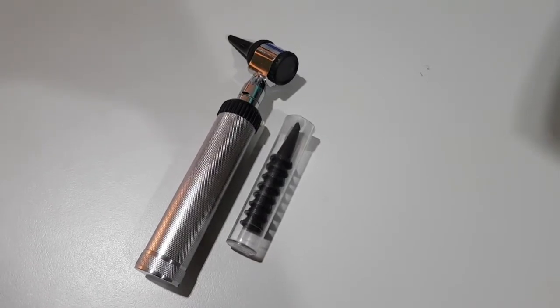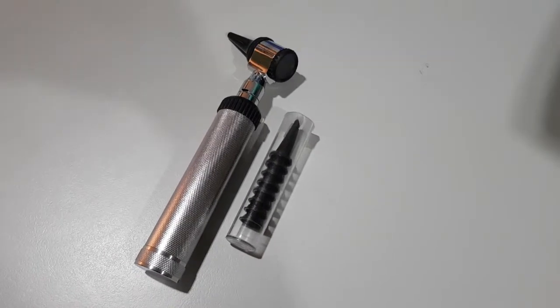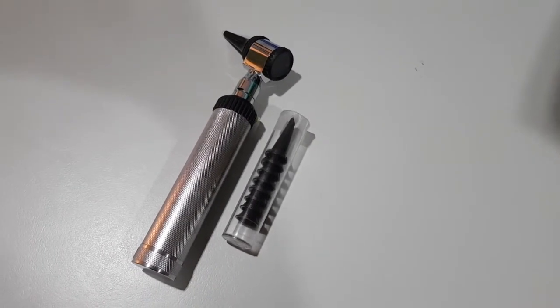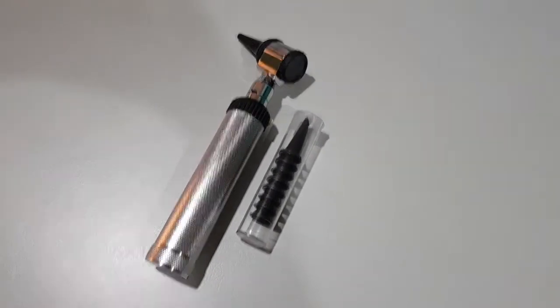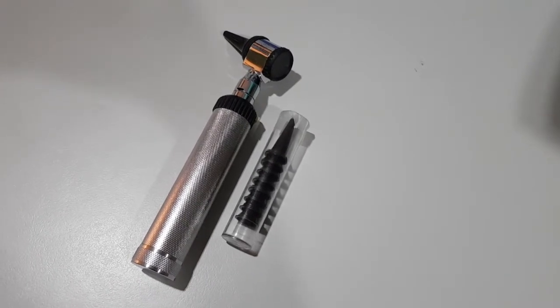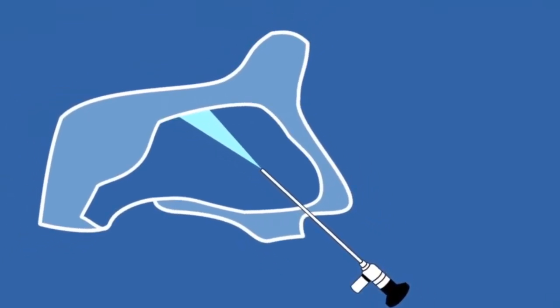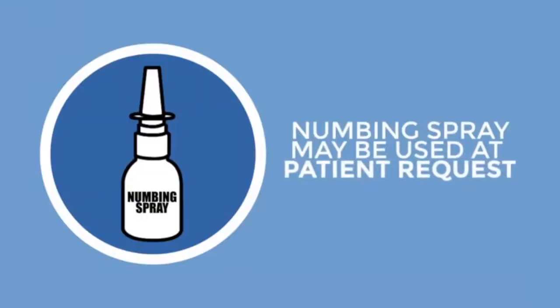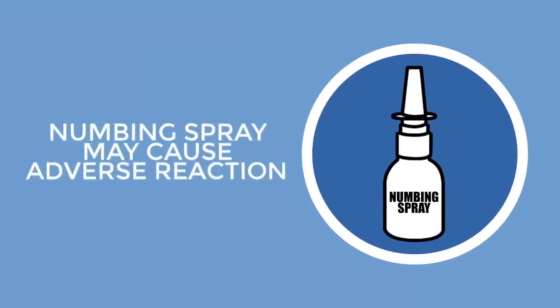Otoscope and endoscopy. Alternatively, one can use either an otoscope or an endoscope to check the nose if available. When using an otoscope with a large nasal speculum, one can have a better view of the posterior aspect of the nose. To check a patient's nose and throat using an endoscope, anesthetize the nose of the patient first by either using a spray or a nose cotton pack with anesthetic on it. Allow adequate time for the anesthetic to work before proceeding.